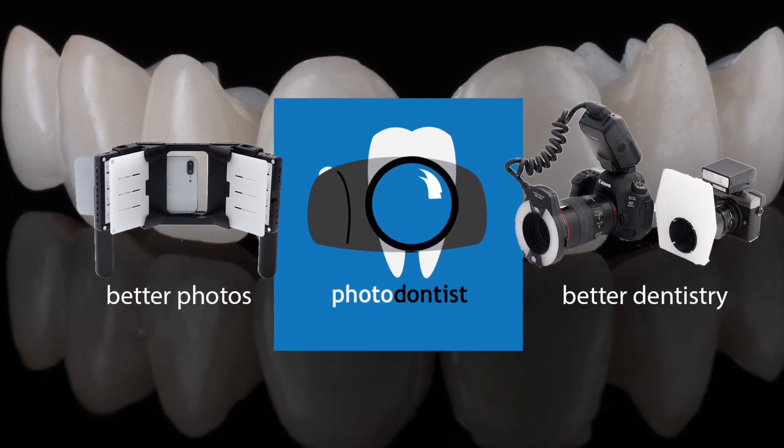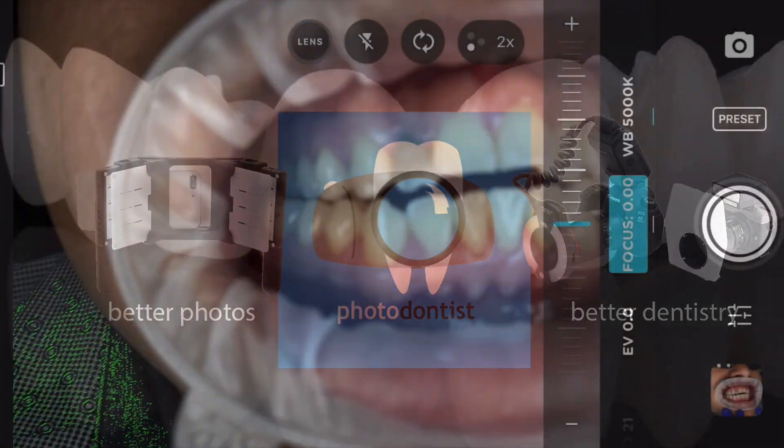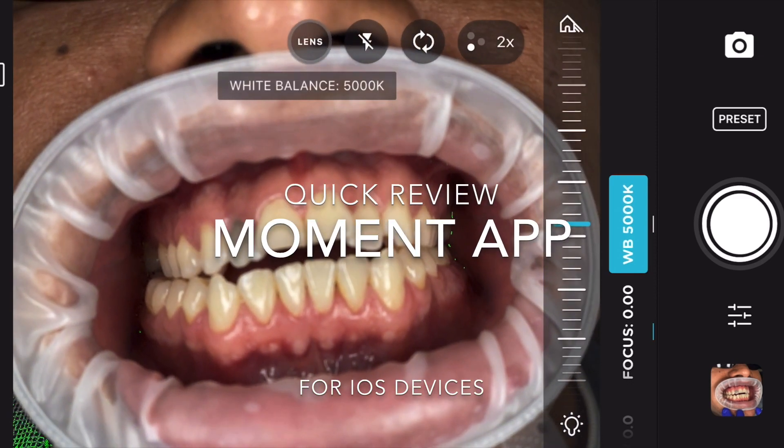Hi, this is Vu, and this is my review of the Moment app. The first thing I like about this app is that it lets you set your white balance manually. Most LED panels are 5000K, but teeth throw off automatic white balance, so being able to set that manually is invaluable.